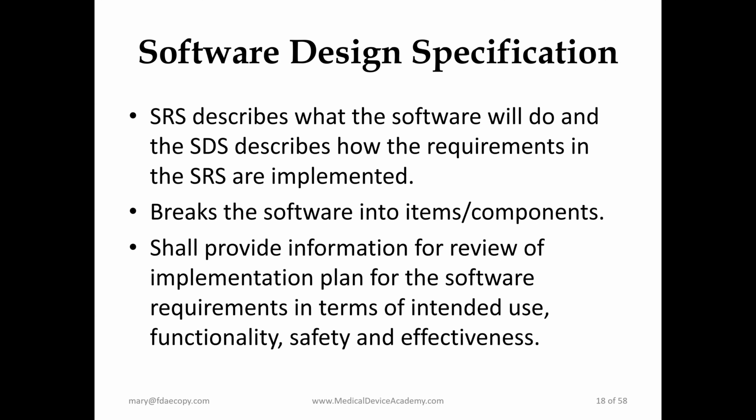If you have specific functions that run algorithms, that's where you can get into more detail on how the algorithm was built. Is there a database or a table it's referencing, or is it AI? This design specification is really where you tell more of the story about how your software works. This document is usually a combination of flowcharts, which can look similar to the architecture, and detailed descriptions of what each of those elements are. Next slide, please.